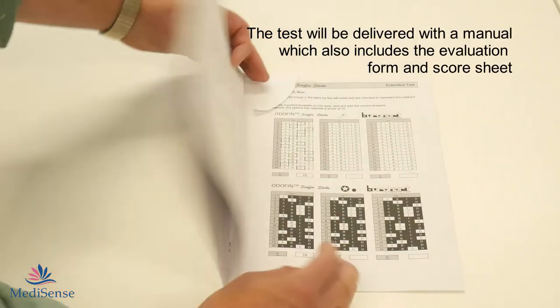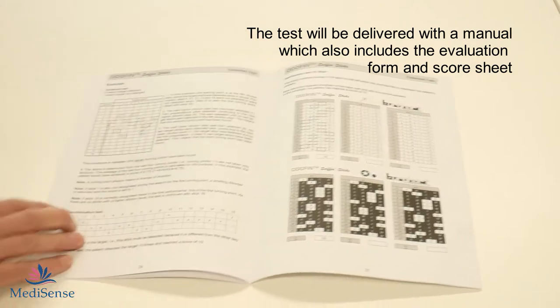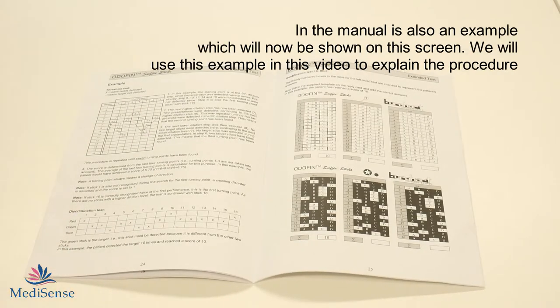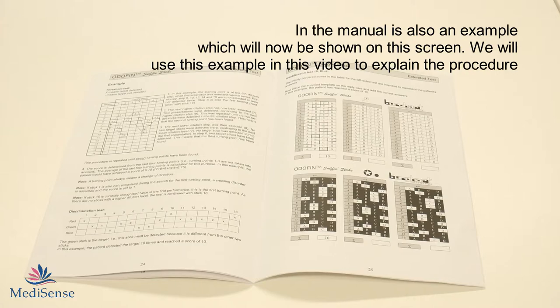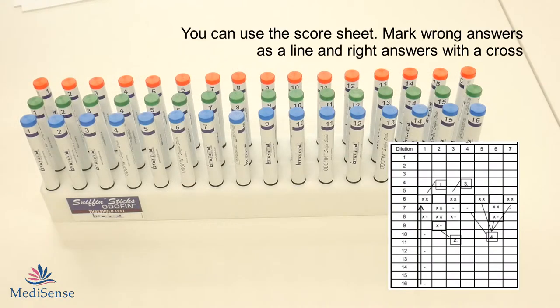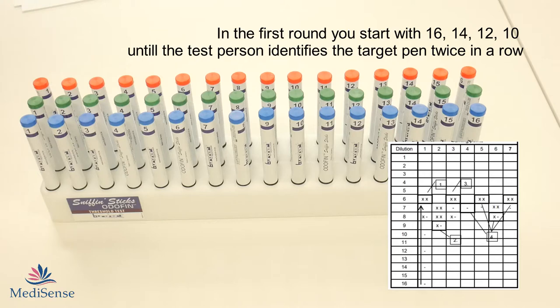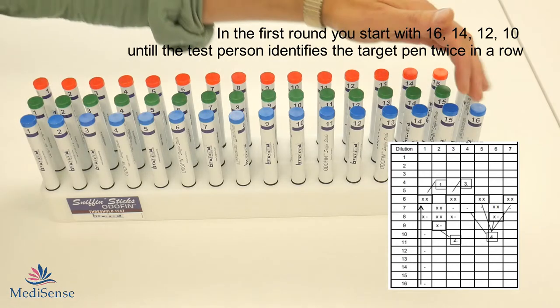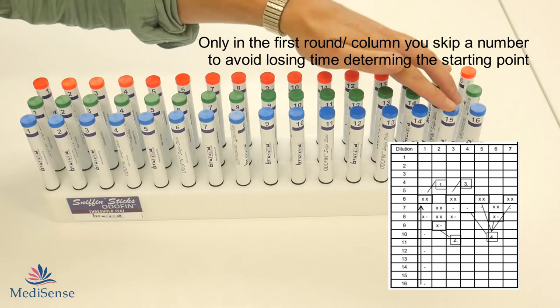In the manual you can find the score sheet on which you can write down if the test person guesses the target pen right or not. If the target pen is not guessed then you continue with the higher concentration and in the first round you skip one set of pens.